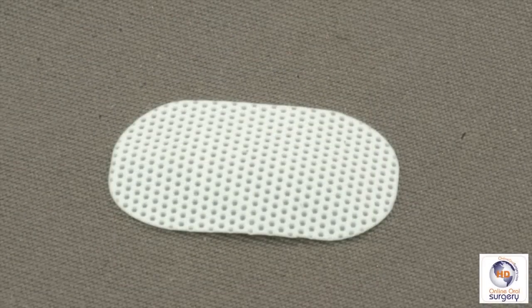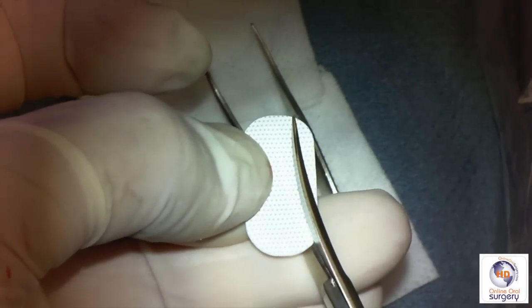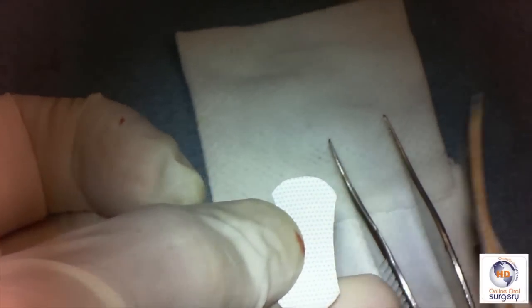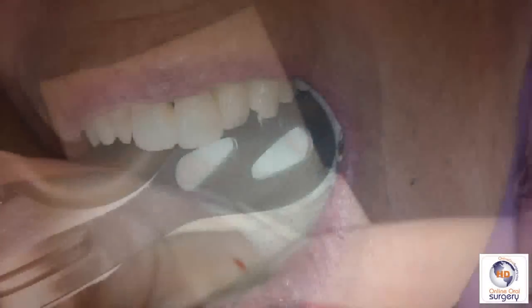This is what it looks like out of the package — it's a very flexible, thin white sheet. We're going to contour it to go interproximally between the second molar and the second premolar, giving it sort of an hourglass shape, with the idea of keeping it about a millimeter away from the adjacent roots. We'll make a little semilunar cut on the mesial and the same thing on the distal, and then take it into the mouth to make sure we've trimmed it adequately. When handling this membrane, we want to make sure we don't puncture it, so we'll use a non-toothed Adson forcep.